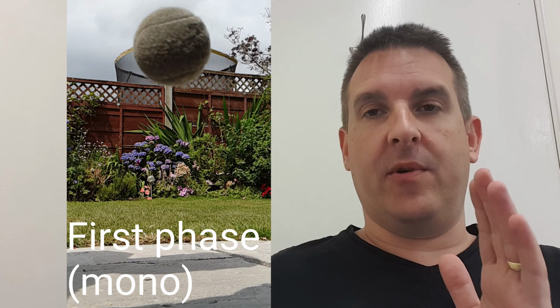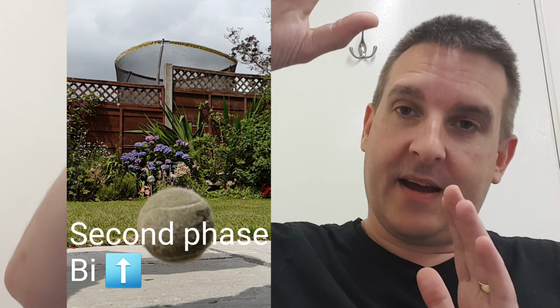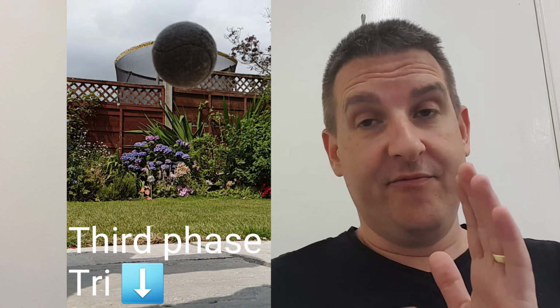So think of what you're hearing as the number of bounces of a ball on the ground. That will give you a feel for what you're feeling. So the first sound is blood coming down, second sound is backflow coming back up, and the third sound is the blood coming back down again. Sometimes you'll even hear a fourth sound. If the arteries are really, really bouncy, it is technically possible to hear and you get a little fourth sound. So what you're hearing is the number of bounces.